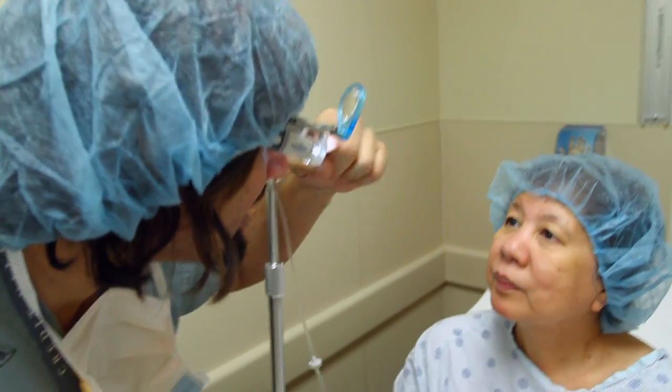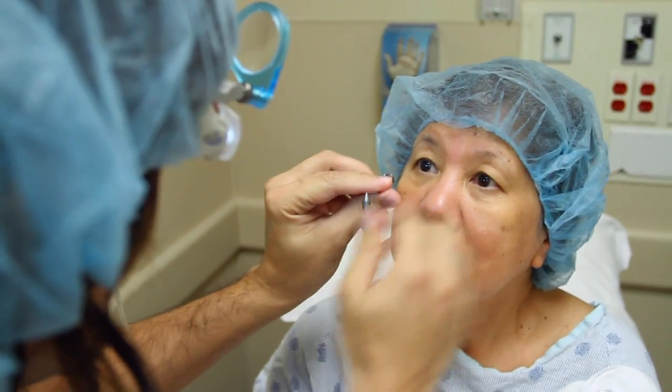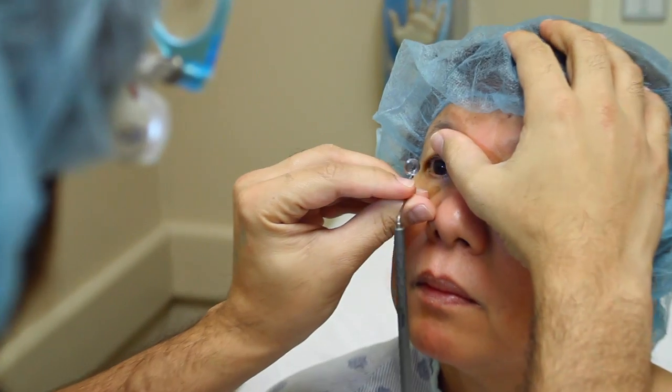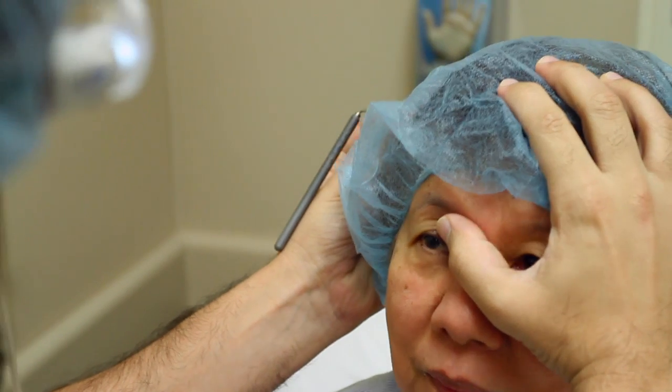I'm just going to be able to look at the white light over here. Should I just cover this one? Look with your right eye actually. I'm going to come forward, come forward a bit. Keep that straight.